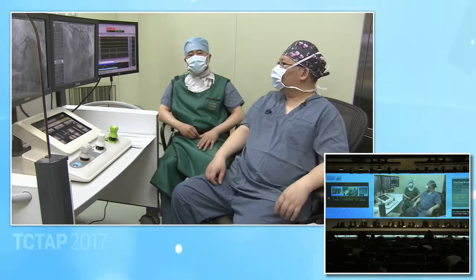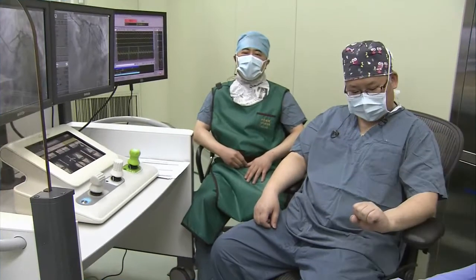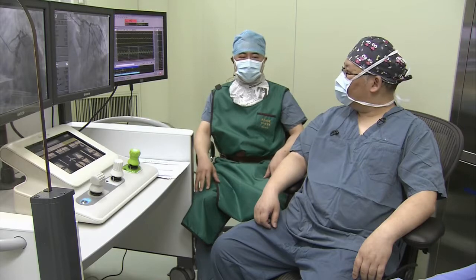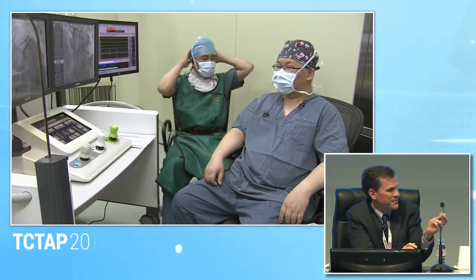If I could make another comment, just to make your life easier, I probably would have treated the distal circ first. I mean, you can have a lot of trouble once you've done the crush to get another stent through there, and so I think just doing that first might have been a little easier. I agree.